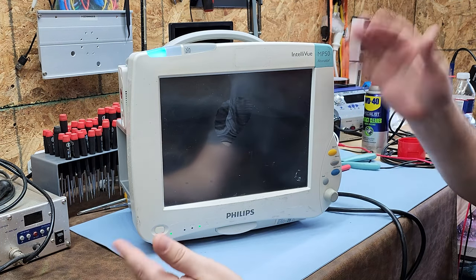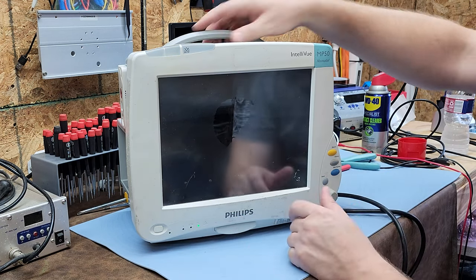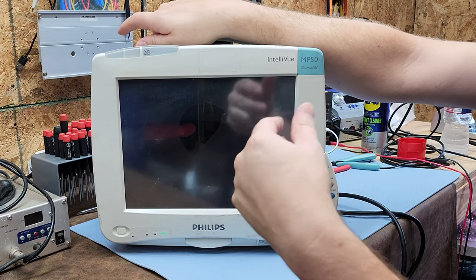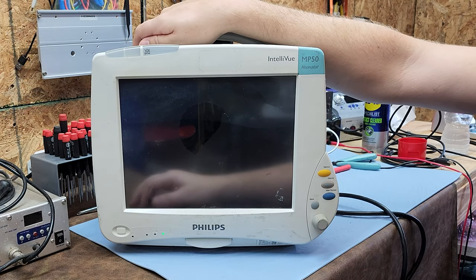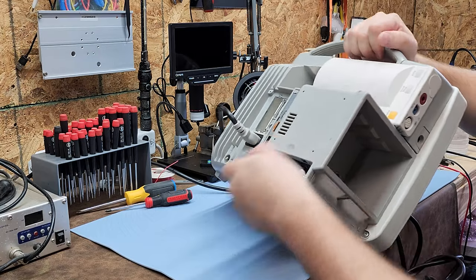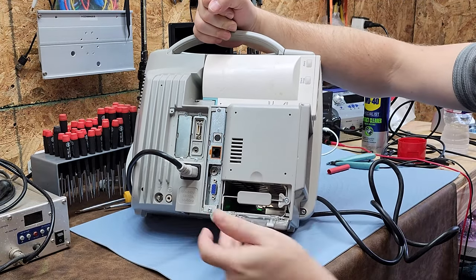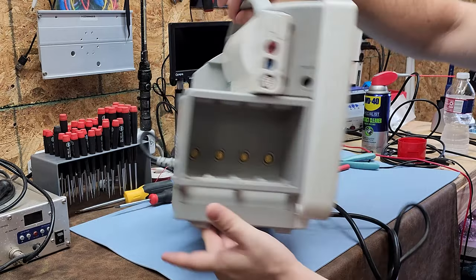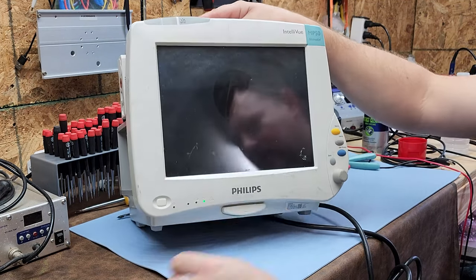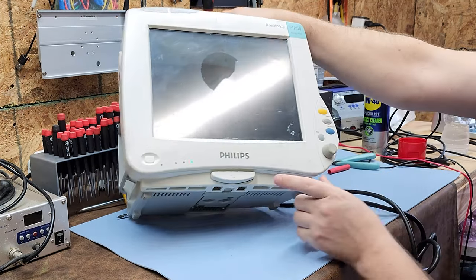As soon as it initializes all parameters, it goes into monitoring mode, which will ask you to admit a patient. I'll go ahead and shut this off. I want to point out that this monitor is labeled for neonatal — there are several parameters that will be different for neonatal monitors. One feature is these brick slots, and it can also serve as a transport monitor with space for two batteries right here.